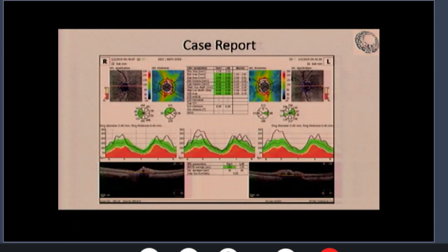That is a good question, because white color could also be in younger patients or in any cause of thickness of the nerve fiber layer over the limit. So it can also be an artifact. That is something we have to keep in mind. Edema of the papilledema can cause bilateral white colors and over limits in all these areas. So the important thing is that the white color could be an artifact. It can be seen in children. It can be seen in any pathology of the retina and optic nerve that increases the thickness. All right?